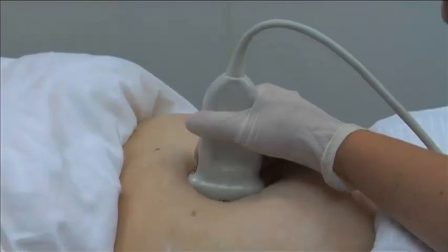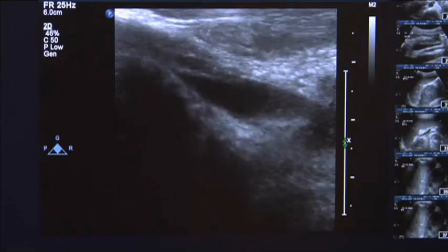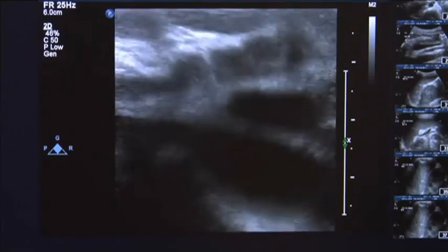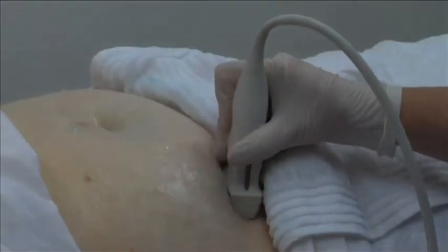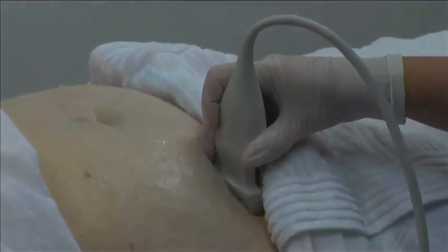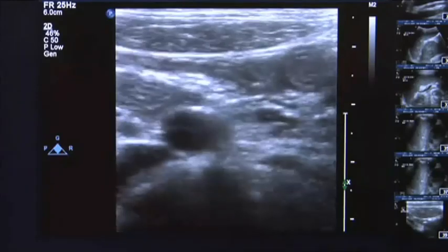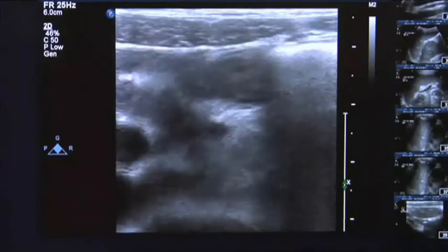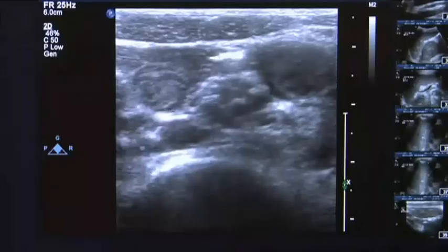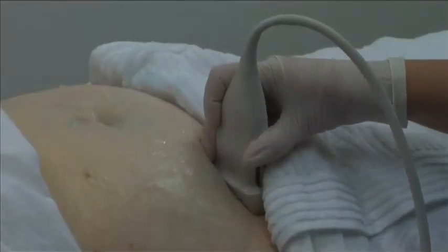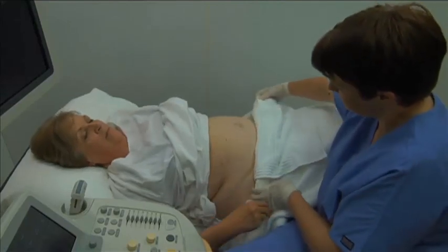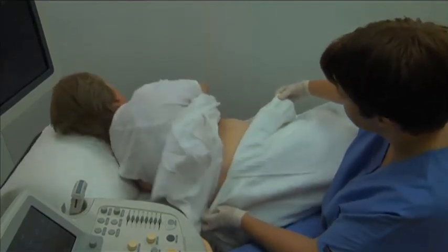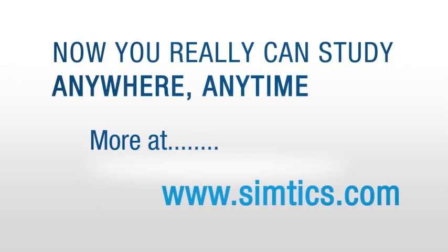Use a gentle graded compression technique to encourage gas to move and identify non-compressible abnormal bowel including the appendix. Rotate the transducer 90 degrees counterclockwise from the longitudinal view until a suitable transverse image of the structure is obtained. This transverse view will most likely be obtained from an oblique scan plane due to the variable position of the bowel. If required, adjust the patient to the lateral oblique position with the opposite side raised to encourage gas to move away from the region of interest.